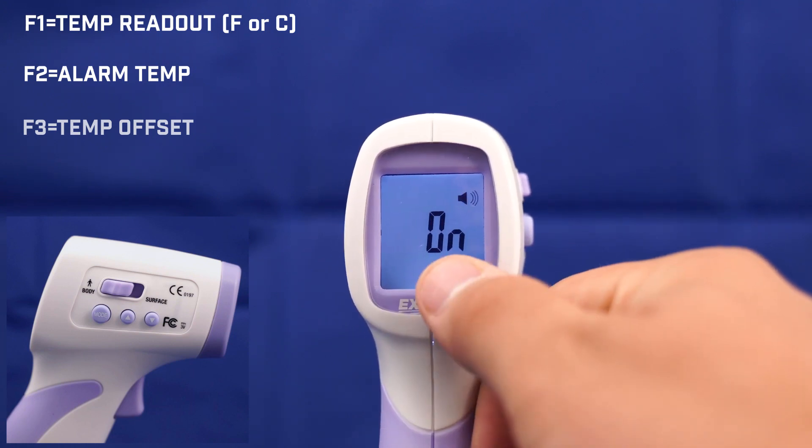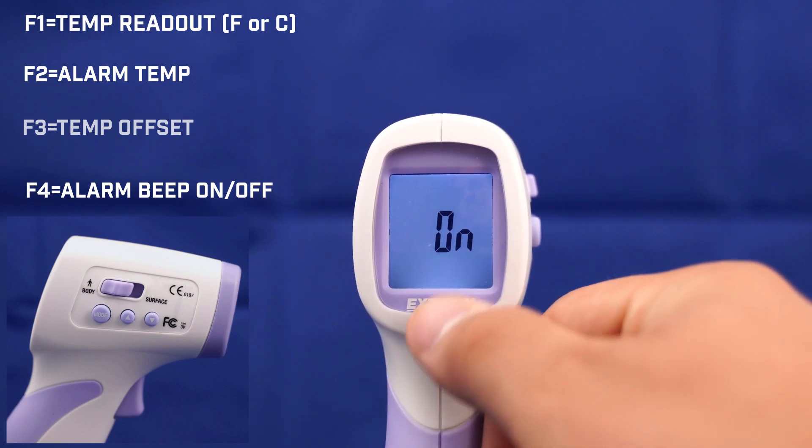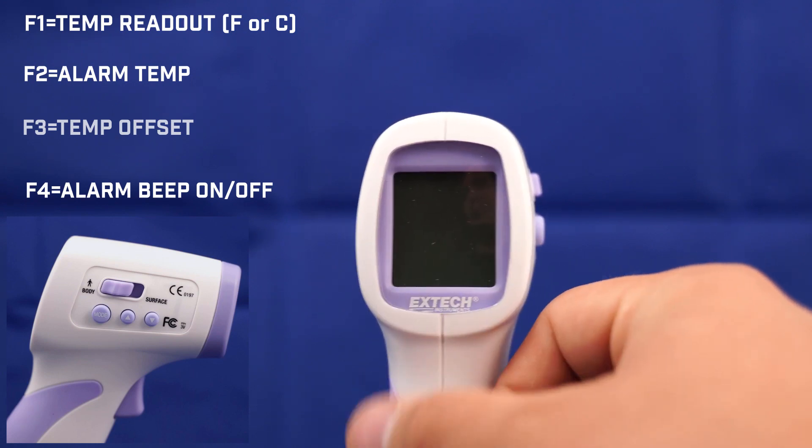The next setup, F4, will allow us to enable a beep for our alarm — the alarm we set in F2 — either on or off.